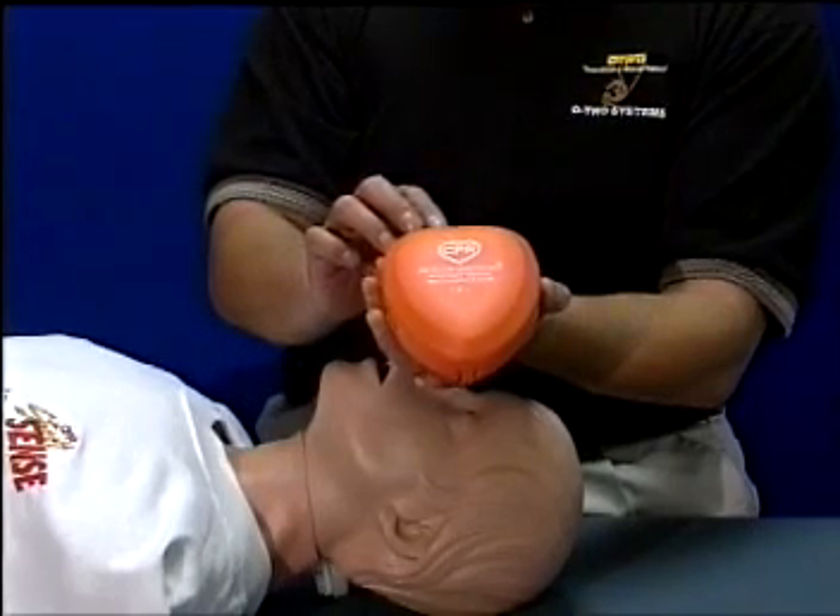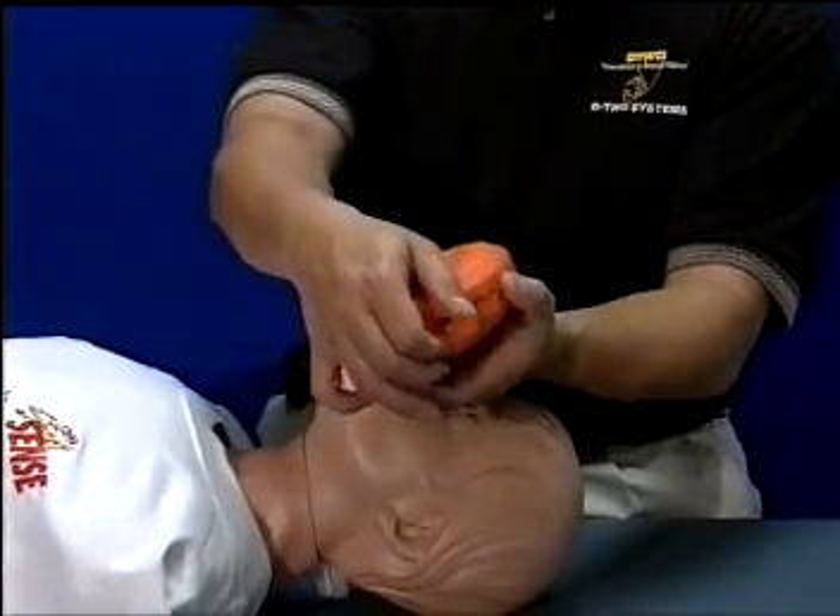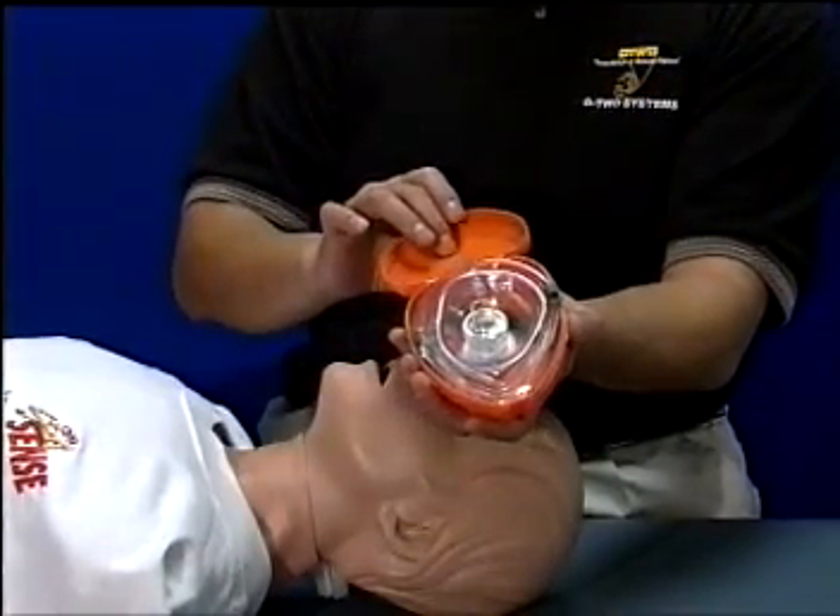The hard storage case has been designed with hold tabs on each side of the case to facilitate easy opening of the clamshell design in case of an emergency.